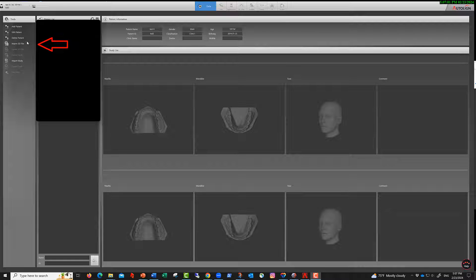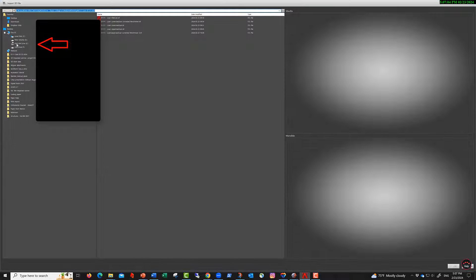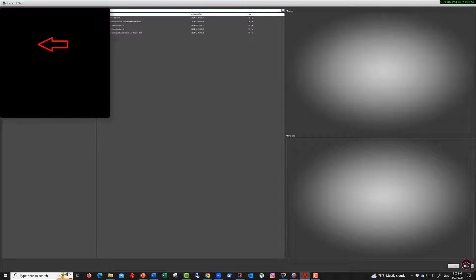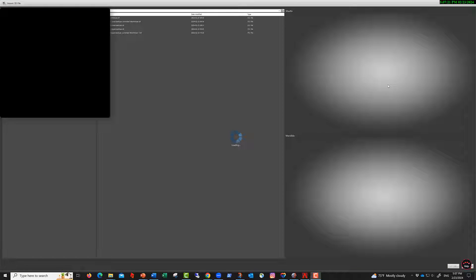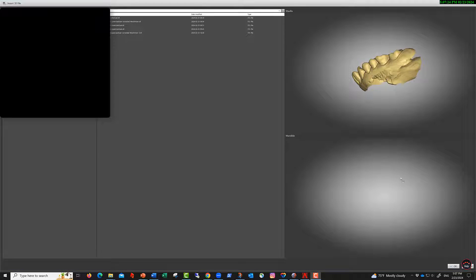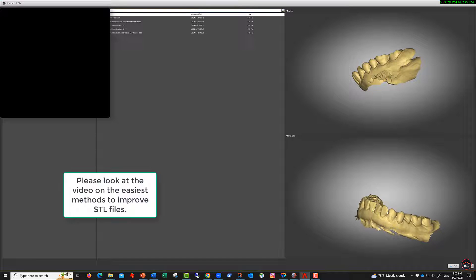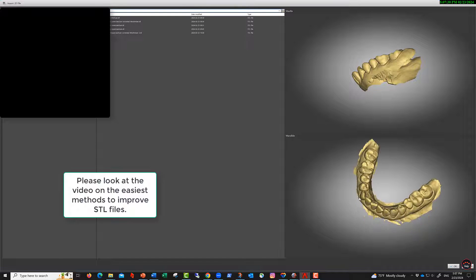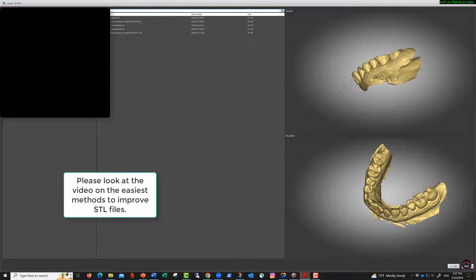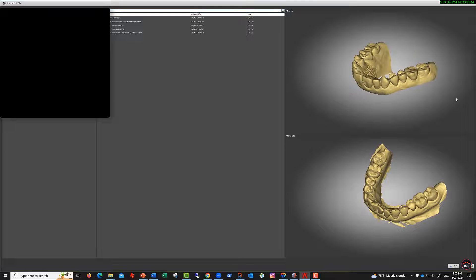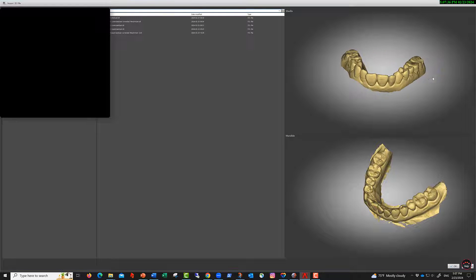Next, you import the 3D files right here. All you need to do is drag and drop — I'm going to take the upper, drag and drop it into the file folder. The lower goes here as well. We'll have another video on this, but I cleaned up the files with Mesh Mixer, since lab bench scanners sometimes require file cleanup.